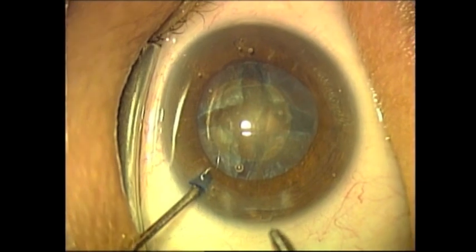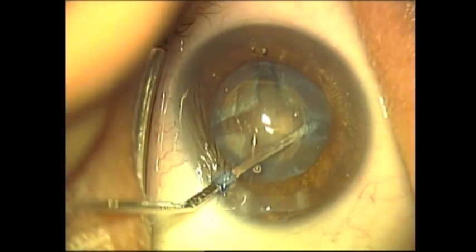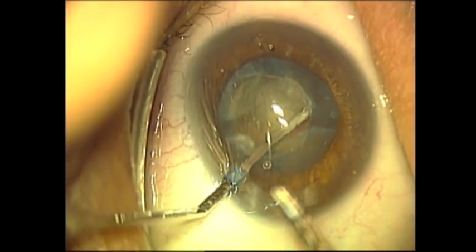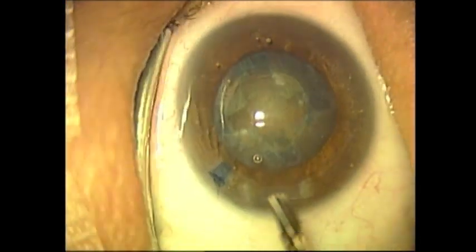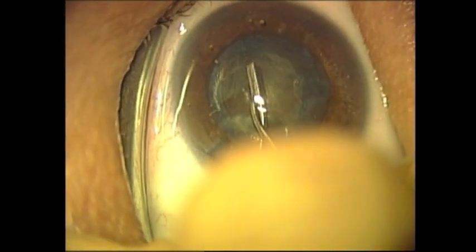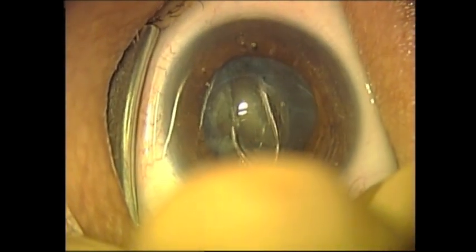A nucleus lens cracker is being used for this procedure. Equal distribution of force to the right and to the left facilitates the cracking of the lens without rupture of the posterior capsule.